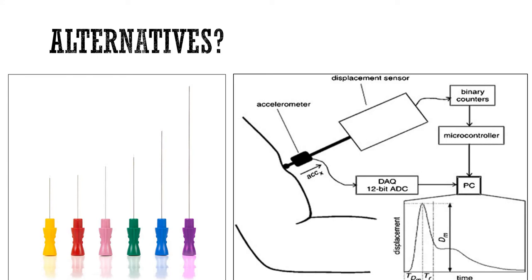Now, one of the real limitations of surface electromyography is that it is only able to assess the activity in superficial skeletal muscles, and by that I mean near the surface of the skin. So when we think of the quadriceps muscles, let's just stick with the four basic quadriceps muscles that we all know and love.